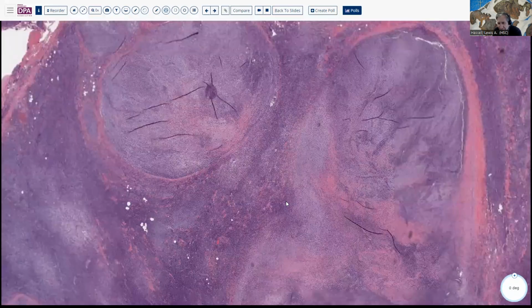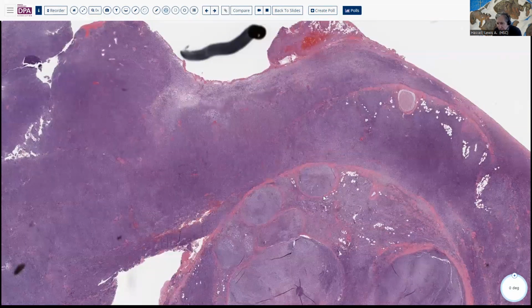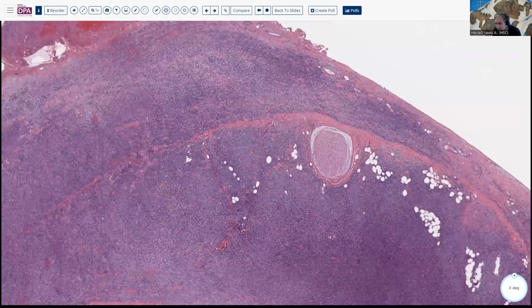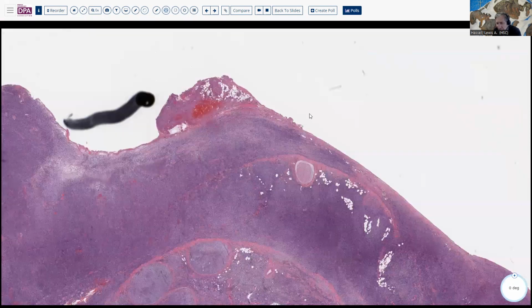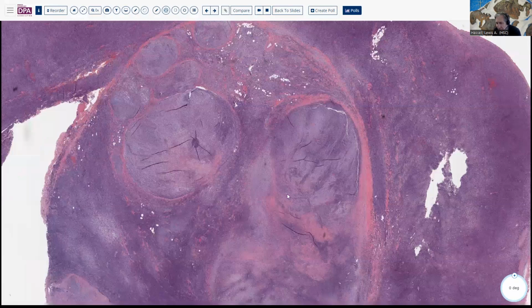Now, in this situation, these neurofibromas are universally associated, especially where you're developing malignancy, with pre-existing nerve. So here's one of the markers for telling you that that's what you're dealing with, the fact that you have this entrapped nerve. And you also still have this somewhat fascicular pattern of a large nerve here associated with this lesion.